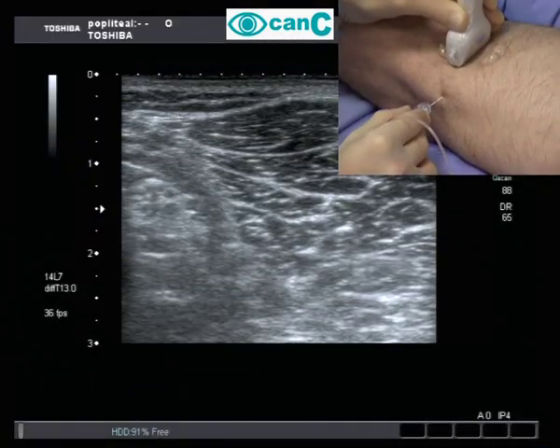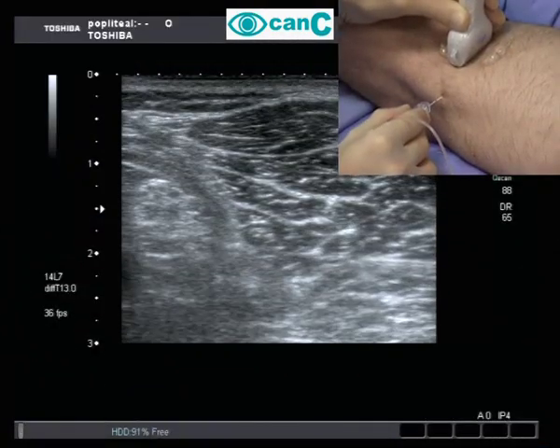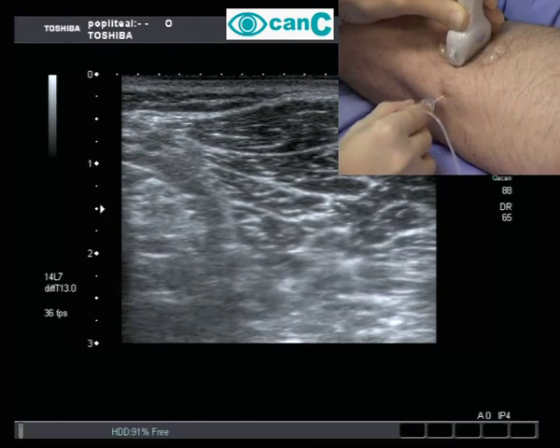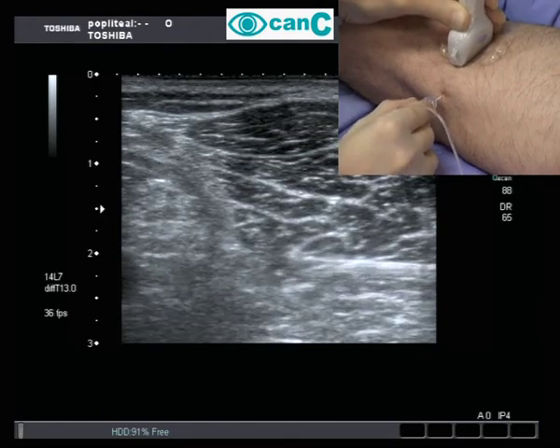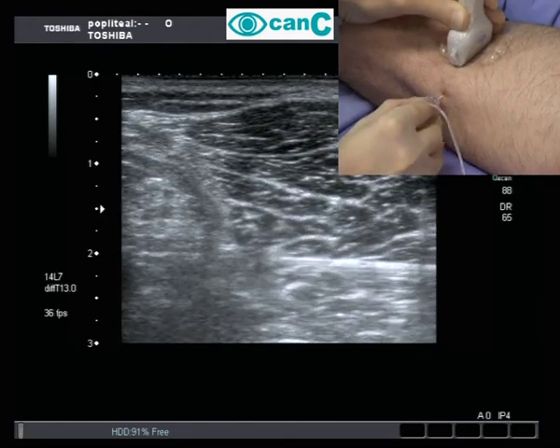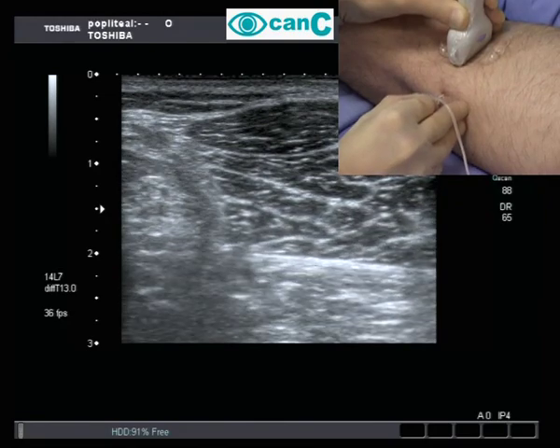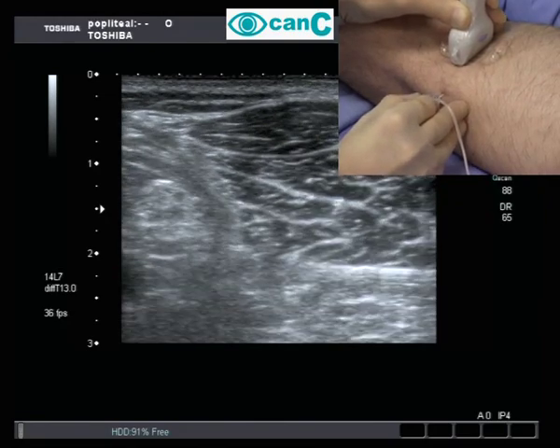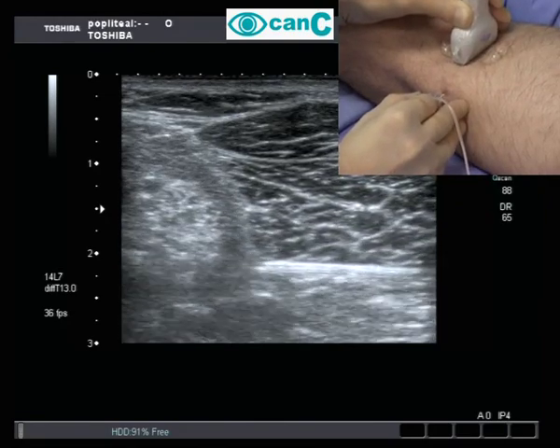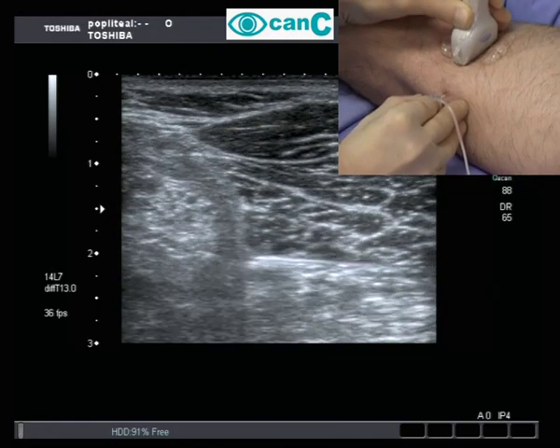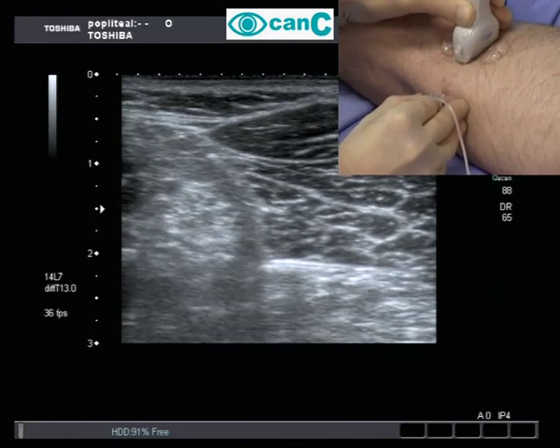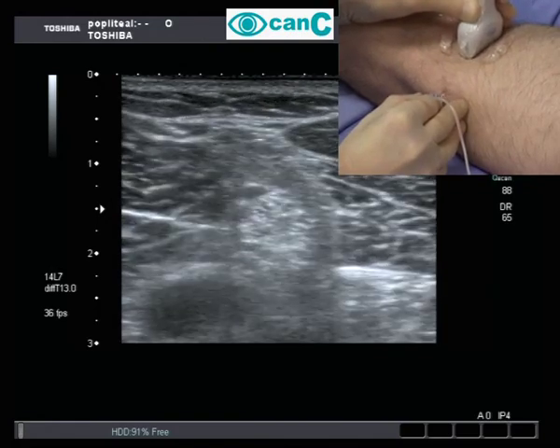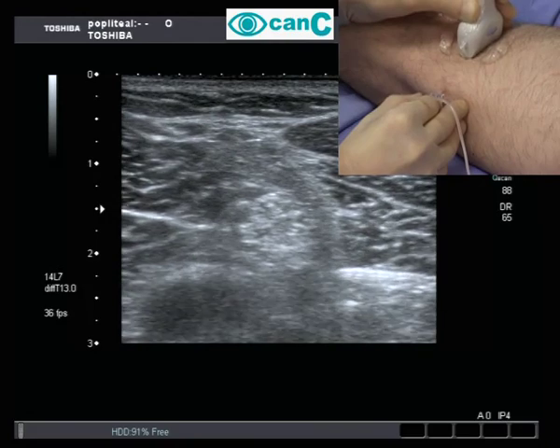The needle is inserted and visualized. It is slowly advanced to lie between the popliteal vein and the sciatic nerve. Small adjustments of the probe angle are needed to improve needle visibility.